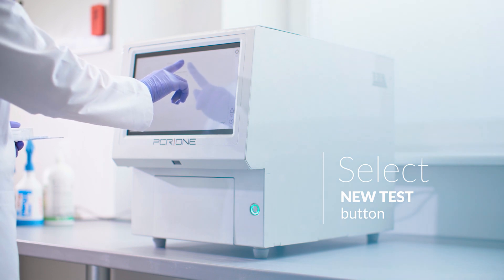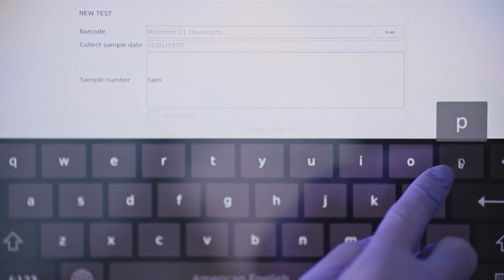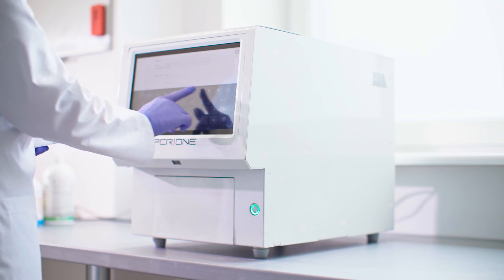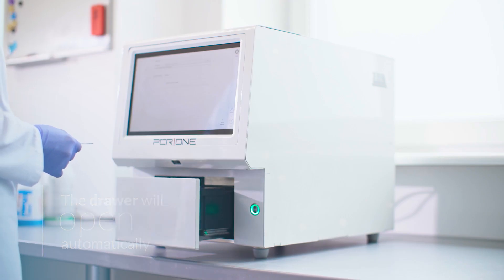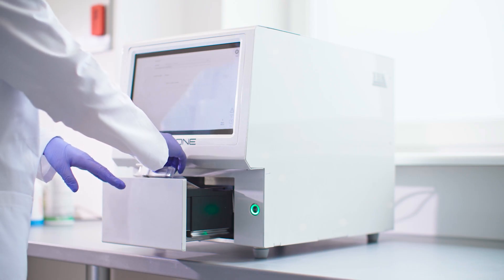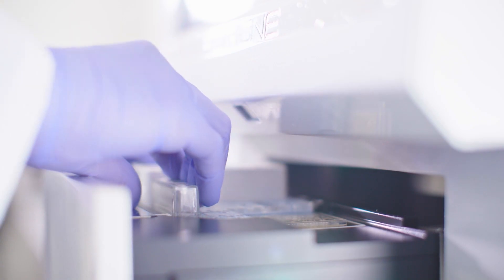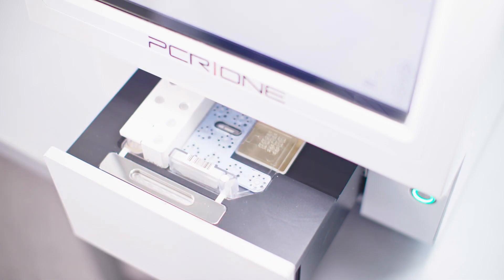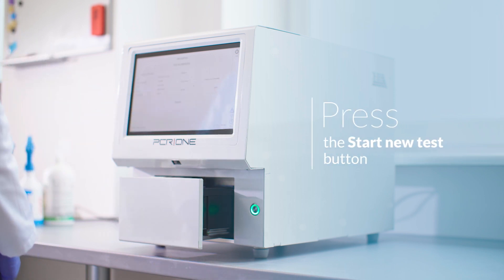Select the new test button in the device's main menu. Pressing the new test button will launch the automatic initialization of the device. During initialization, the software will display the new test window where you must complete the following fields: sample collection date and sample number. Wait until the device drawer is automatically ejected after initialization before inserting the panel. Place the PCR1 MRSA MSSA panel in the analyzer drawer by inserting the back edge of the panel first and then its front edge. The device will check if the panel is properly placed inside the drawer frame and will scan the barcode label located on the panel. Once this is done, you can begin the test by pressing the start new test button.